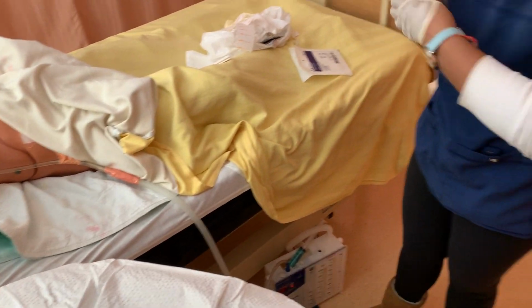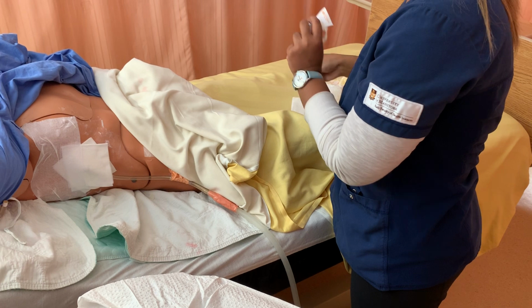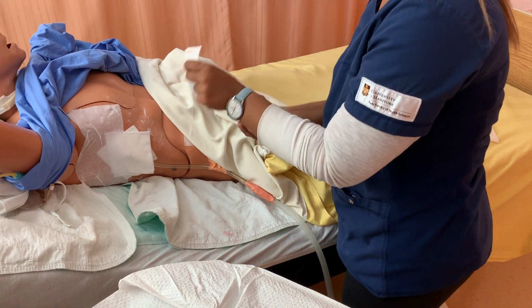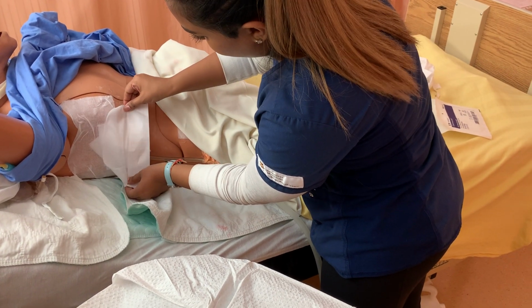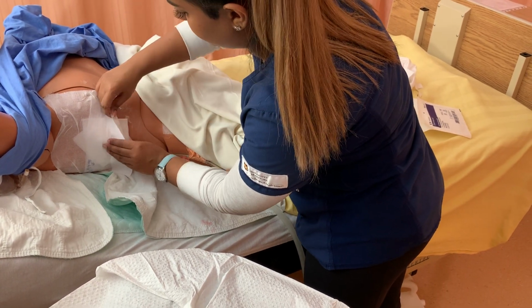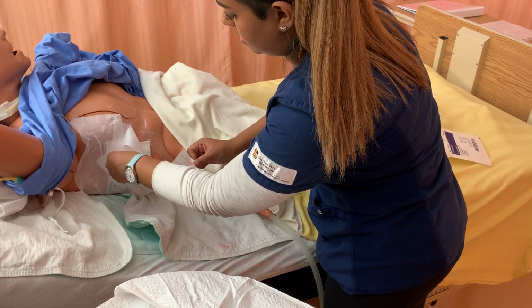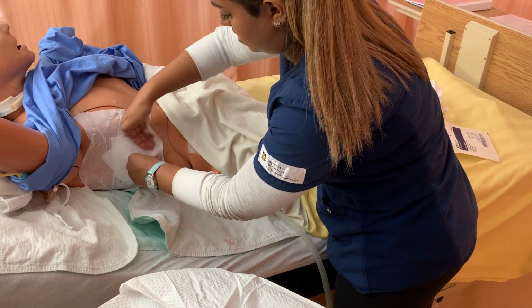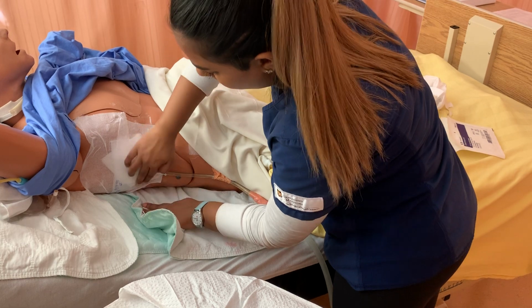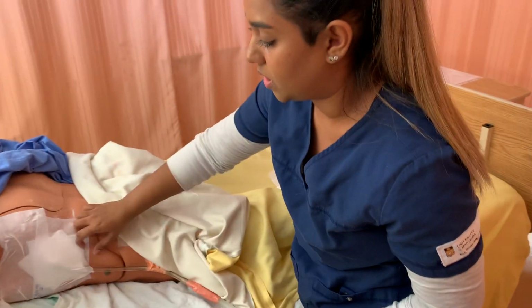And I can get rid of my gloves. This one I have initialed, timed and dated. Again, making it fully occlusive here. And I'm gonna tent the tube here. You can add a little piece right there and tent again. But other than that, my patient is okay.